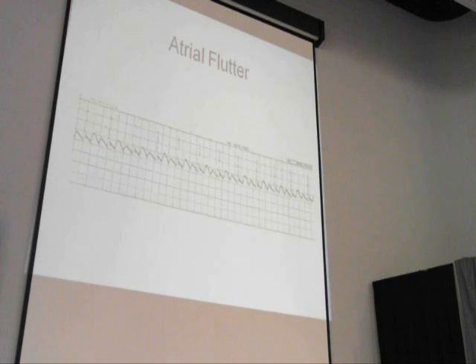When you look at this atrial flutter, what's our ventricular rhythm? Is it regular from one R to the next? Is it irregular? Is there just one P wave or more? Can you distinguish and pick out a definite P and T between those QRS complexes?